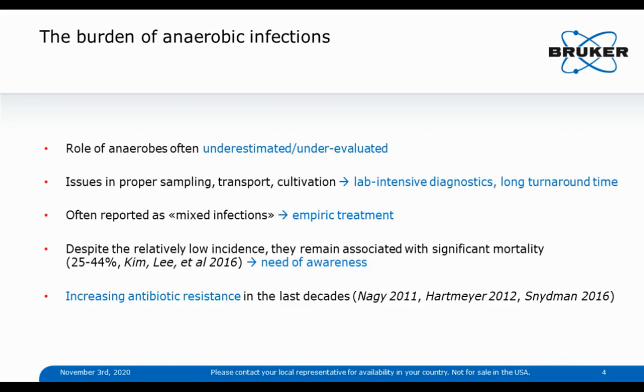Anaerobic infections represent a burden for clinical microbiology diagnostics, and the role of anaerobes as causative agents of severe infections, despite being well known, is still nowadays neglected and underestimated. This is partially due to the fact that they are traditionally fastidious to process, handle, and test in clinical microbiology routine, as they are often slow-growing and require dedicated incubation conditions.